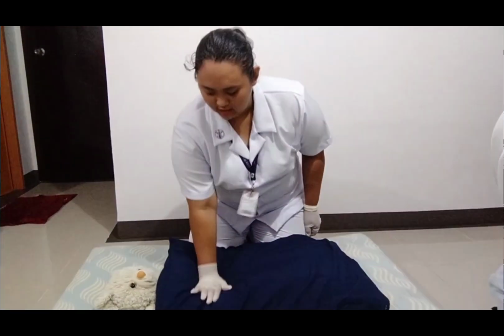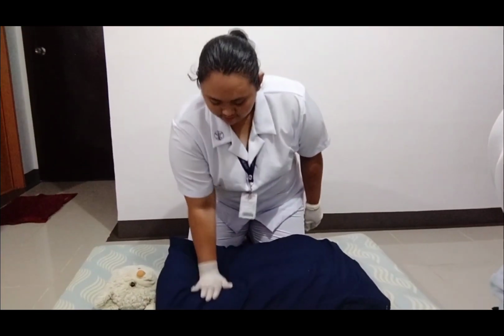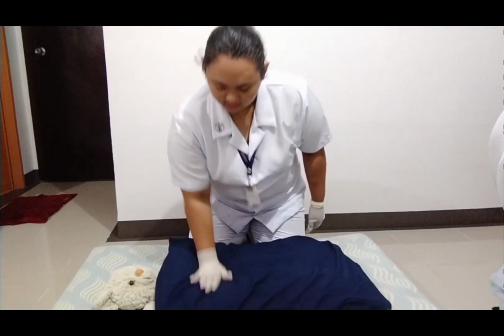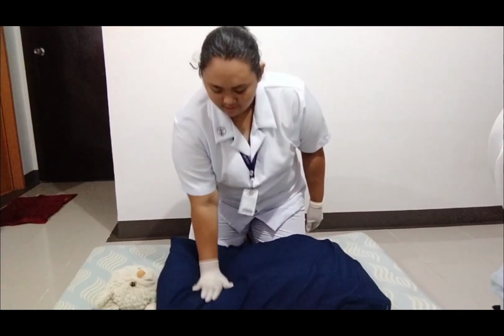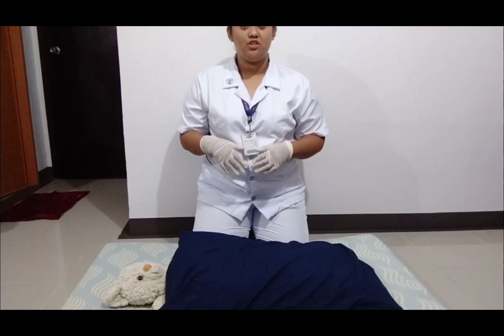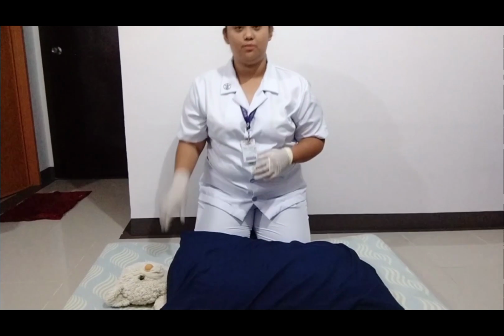1, 2, 3, 4, 5, 6, 7, 8, 9, 10, 11, 12, 13, 14, 15, 16, 17, 18, 19, 20, 21, 22, 23, 24, 25, 26, 27, 28, 29, 30. So still the depth of the chest compression should be at 1 to 1 and a half inches and then give the patient 2 rescue breaths.